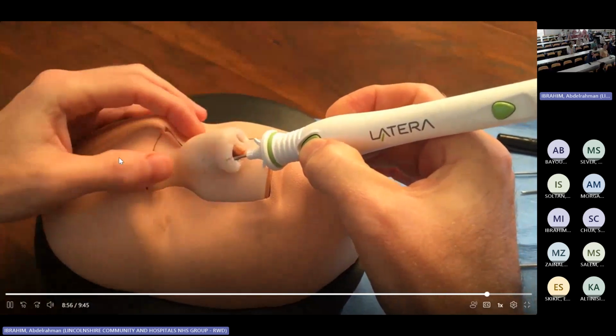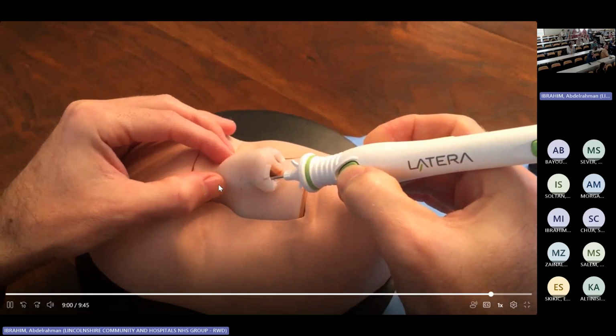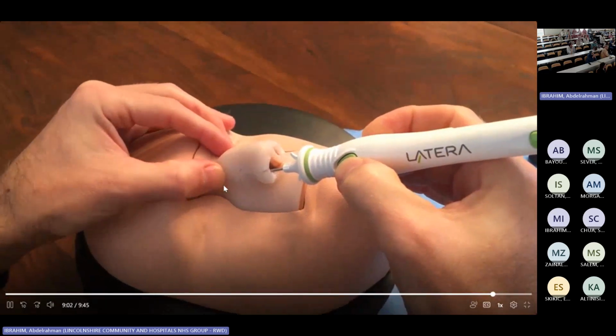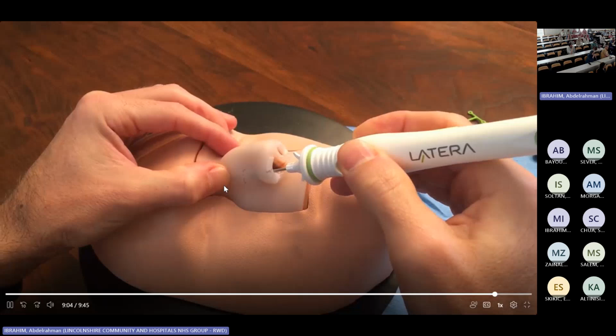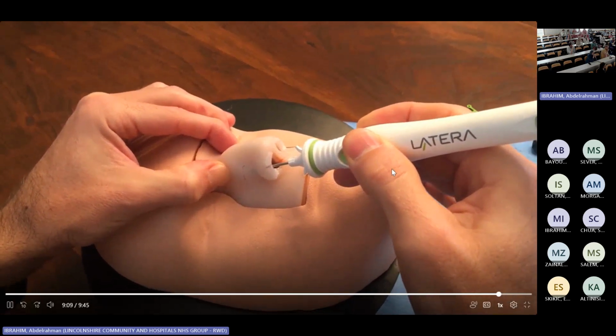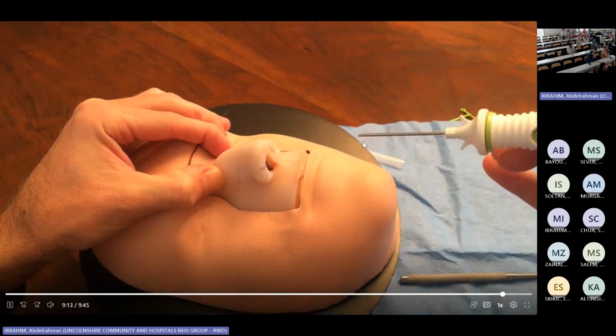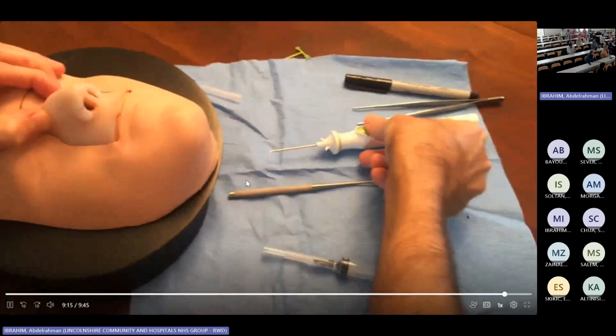So deployed. I will gently support the distal forks, which is right above my distal mark, with my finger, and I will pull back the delivery device in the same plane that I entered in. Perfect. So I'll put that down.